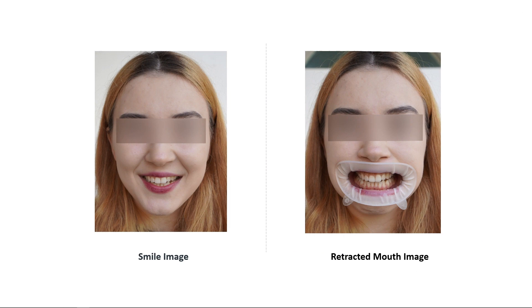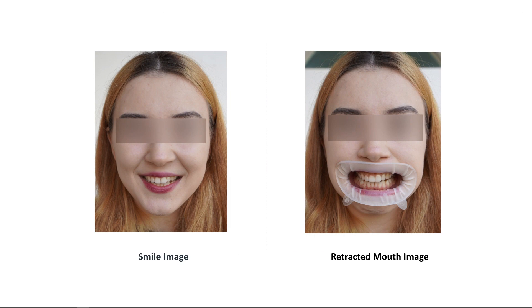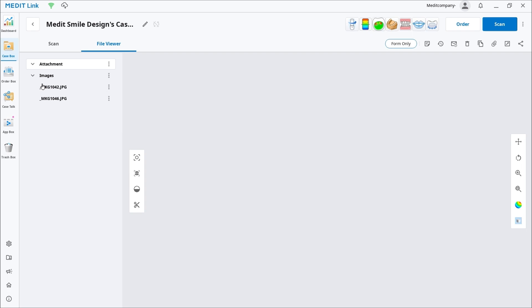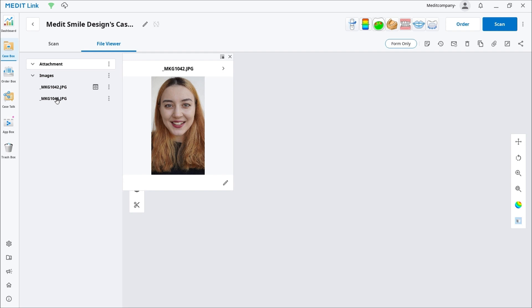Medit Smile Design usually requires two images: a retracted mouth picture and a smile image. Ensure both photos are taken from the same angle for better alignment. Go to the Case box or Work box and choose the case you would like to work on. The case must have 2D images attached to it, and you need to attach at least two 2D photos. You can import images using the Import Images feature.